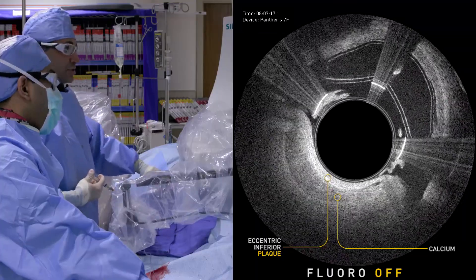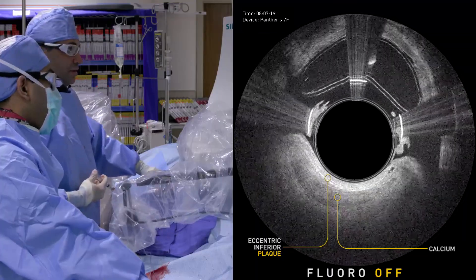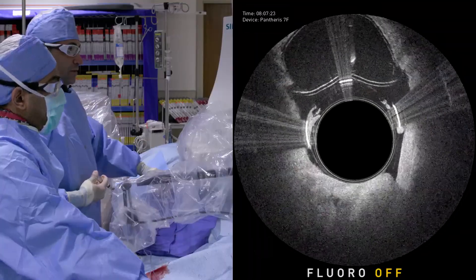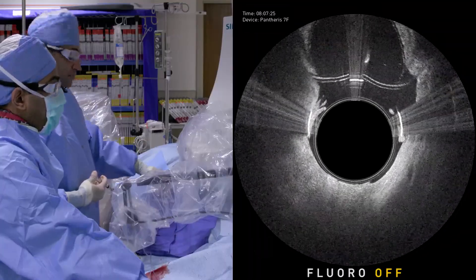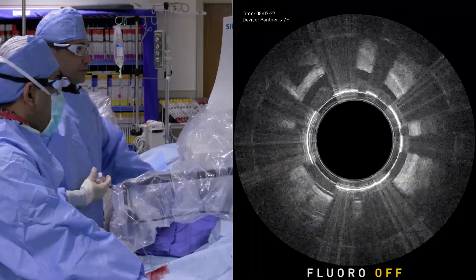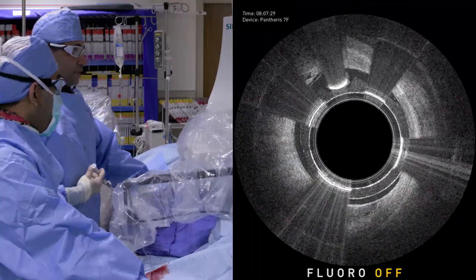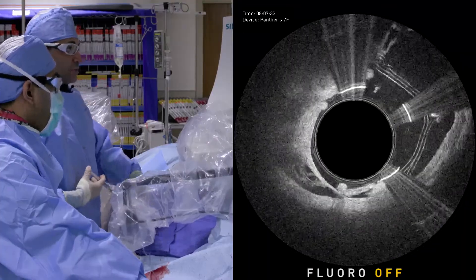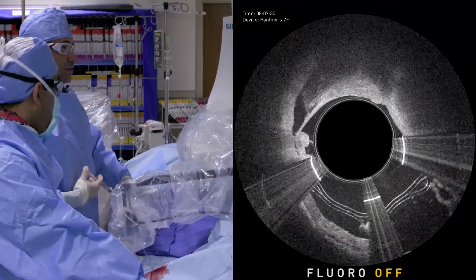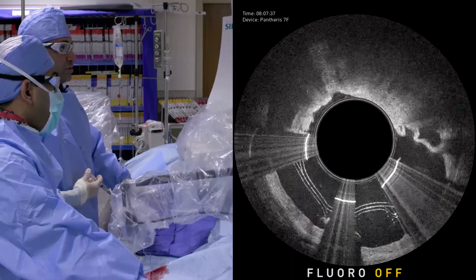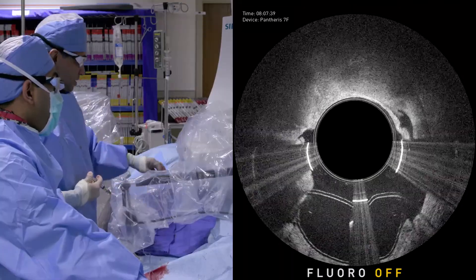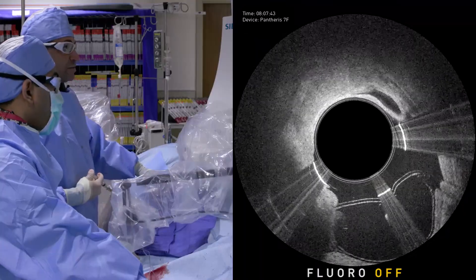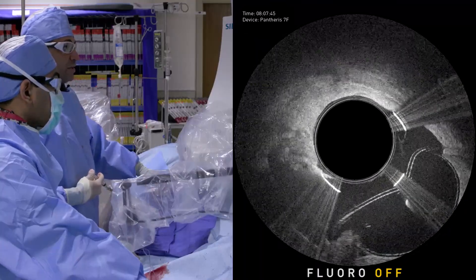And I'm going to advance. Here you see media. Close. Deflate. Open up. Identify our lesion. Inflate balloon. And advance.